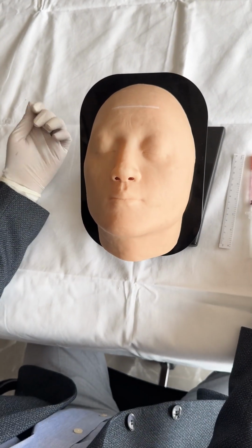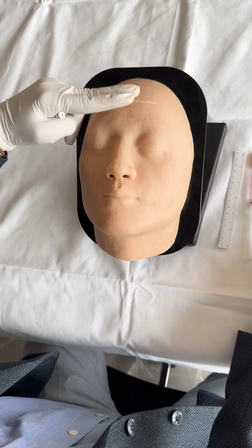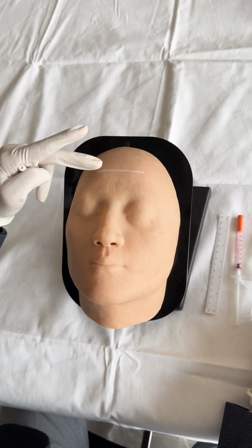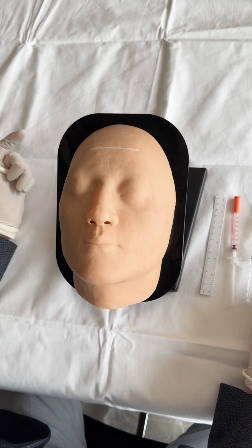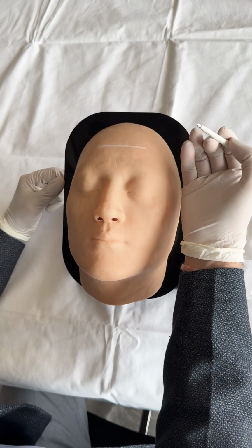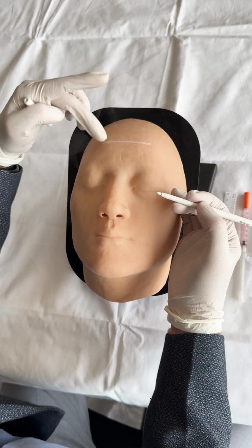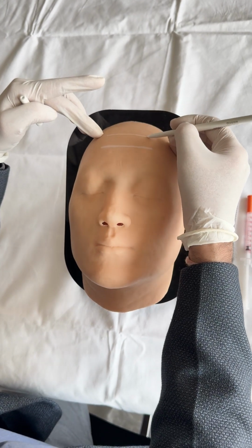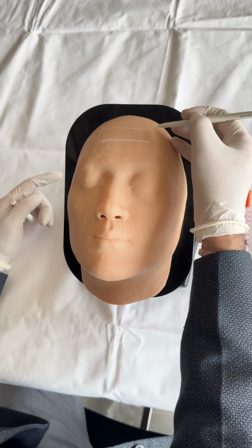Let's mark a line on the forehead, which is supposed to be the first line, two finger widths above the arch of the eyebrows. Start marking the lines in a similar fashion as we do on a real patient's face, marking the various lines where exactly we want to place the botulinum toxin injections. We can draw the lines in the mid-pupillary line very easily in these models.